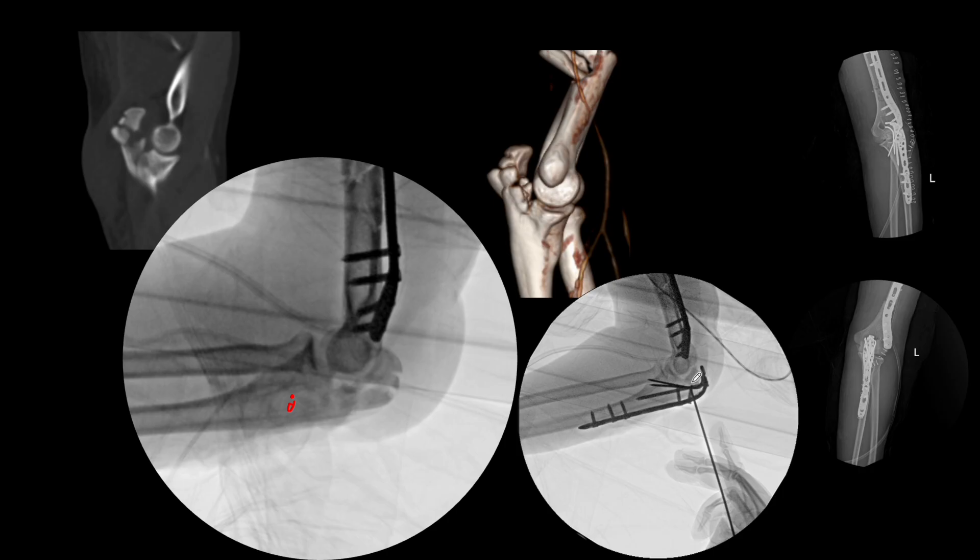You see here we have placed two K-wires — they need not be parallel; you can place them in any direction as long as they are stable enough to secure this fragment. Then you can place the plate as shown here. There is no need for placement of a screw in this zone; otherwise you are going to shatter this small fragment. Then you can place the remaining screws in the routine fashion and start range of motion, because your fragment will be stable — first because the triceps is now putting force directly on the proximal ulna, and second because the fragment is now secured with K-wires that are not going to migrate. This was the post-operative radiograph in AP and lateral views.